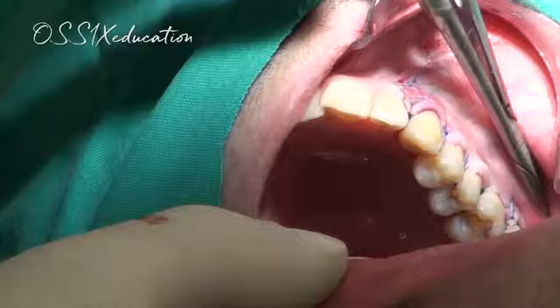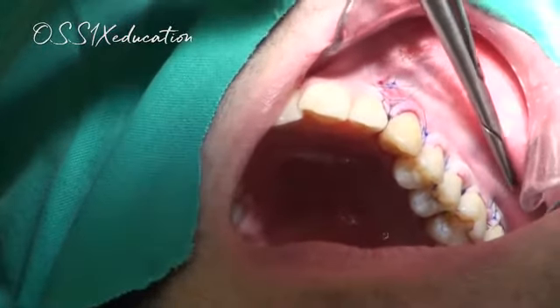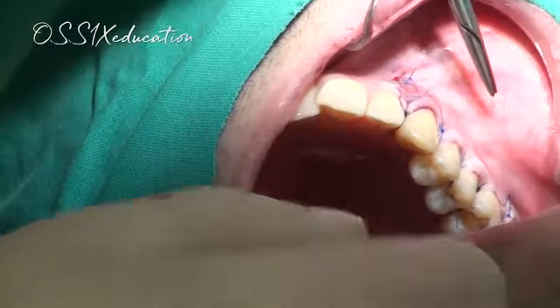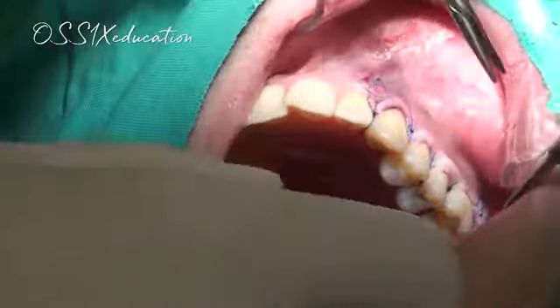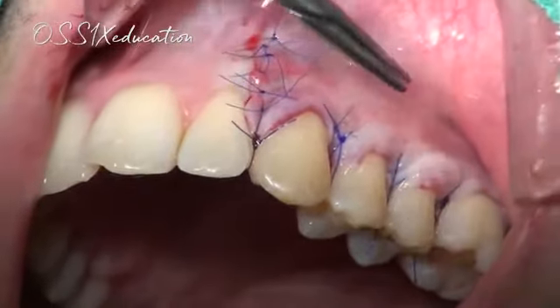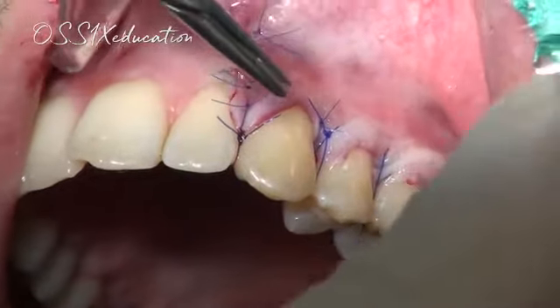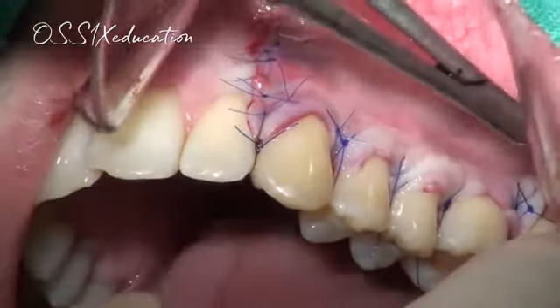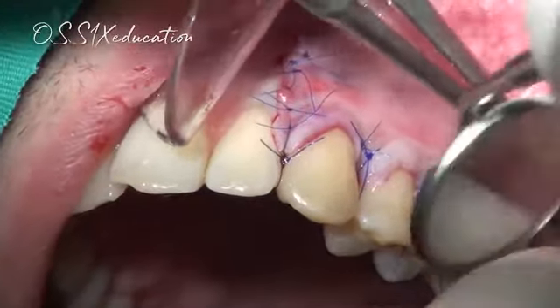I tried it in the lower anterior front. It's very difficult to achieve a 100% root closure. The best outcome is from premolar to premolar in the upper jaw, no doubt about it. Then the second best outcome are, let's say, the lower premolars or a lower canine that is not positioned in a different direction. Molars are so-so. Sometimes it works really nice, sometimes it's not. It's like a hot and cold outcome.